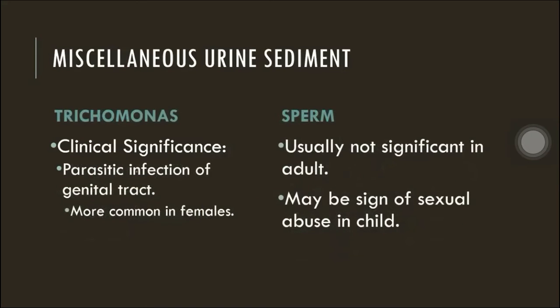Next, we have trichomonas, the most common parasitic infection. Okay, parasite seen in or encountered in urine specimen. So again, parasitic infection of genital tract, more common in females.